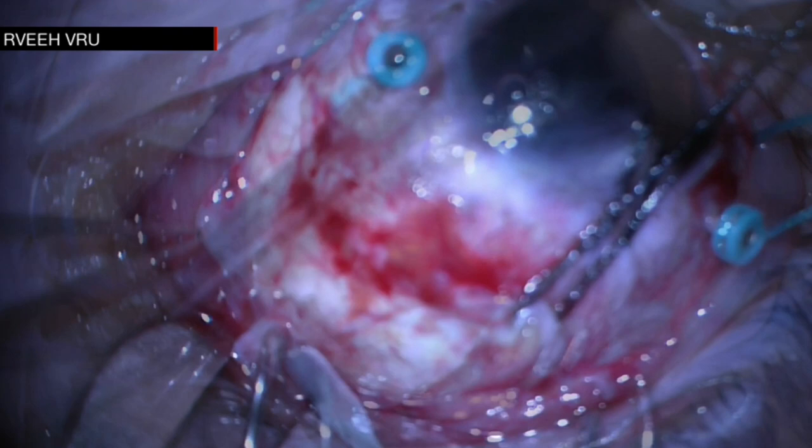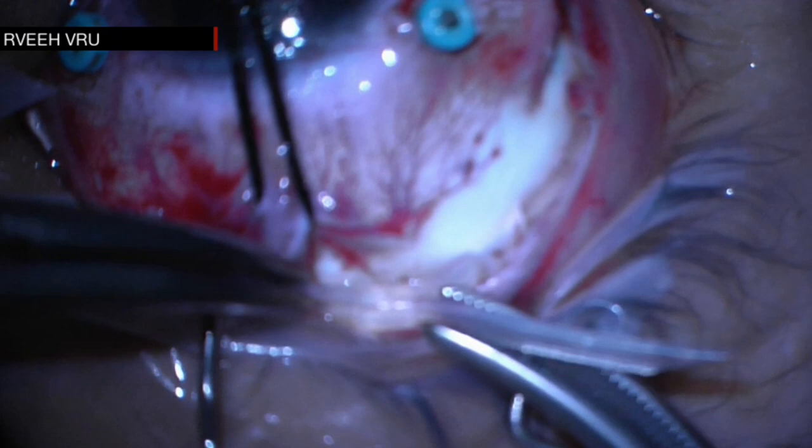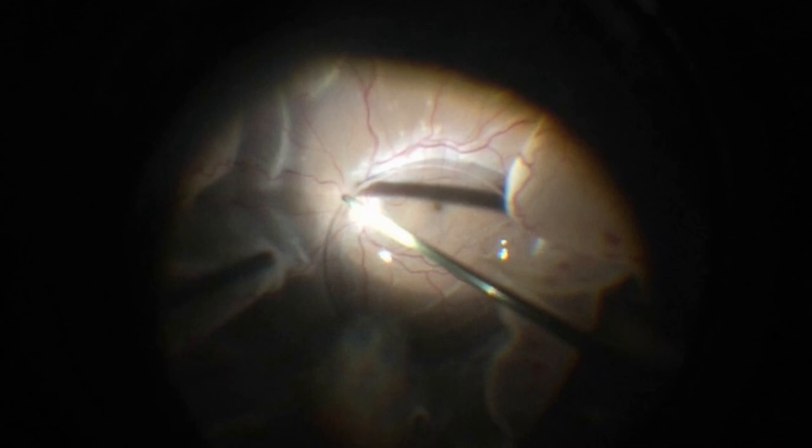After passing the buckle into the four scleral tunnels in all quadrants and behind the muscles, the band is tied using a standard sleeve. The perfluorocarbon liquid was then used to flatten the retina, and retinopexy was made circumferentially around the area of the giant retinal tear and the scleral indentation.